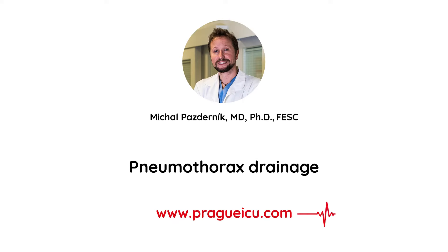Hi guys, I'm Mikhail from Prague ICU and today I will show you how to perform pneumothorax drainage in a triangle of safety using a small bore 8 French pneumothorax kit.